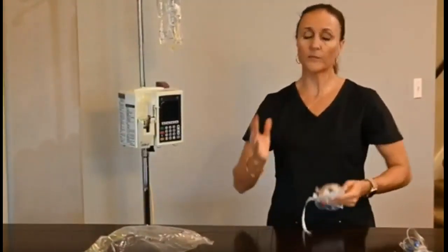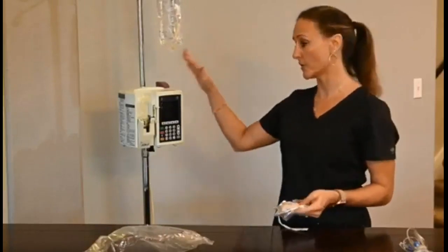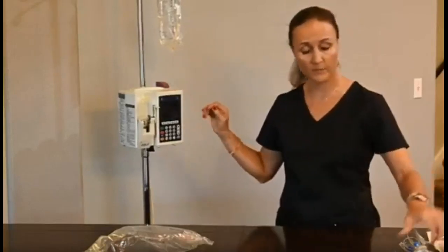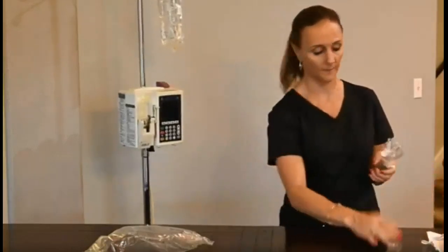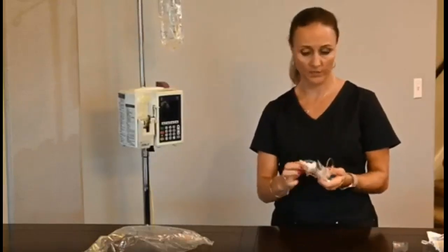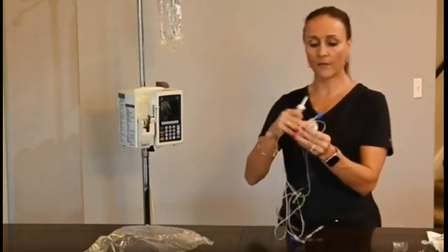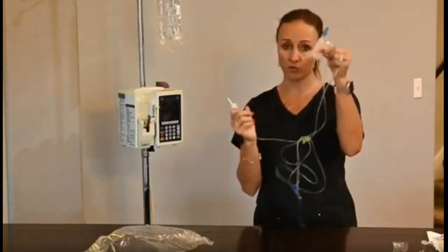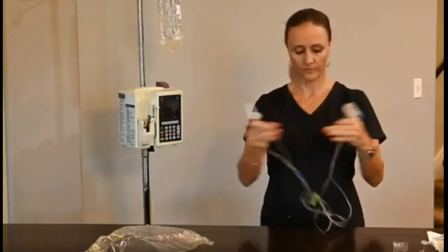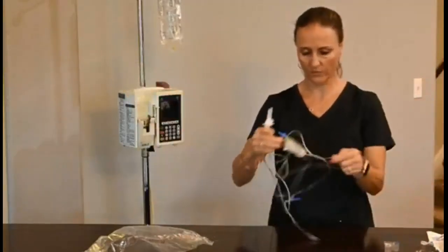Now, depending on where you go, there is different types of primary and secondary tubing based on the type of pump. This pump is called an Abbott or a Plum pump, so I need to have a specific type of primary tubing for that. This one's been used, but they would always be new in a facility. But in lab, you're going to have used ones. With the Abbott or the Plum, it comes with what's called a cartridge. So what I would end up doing is trying to unwind.